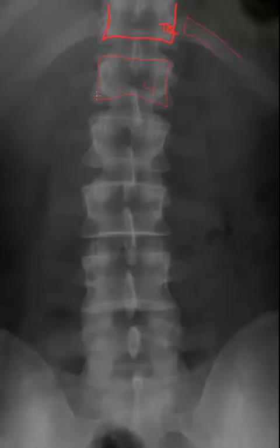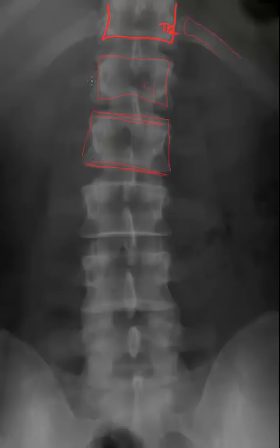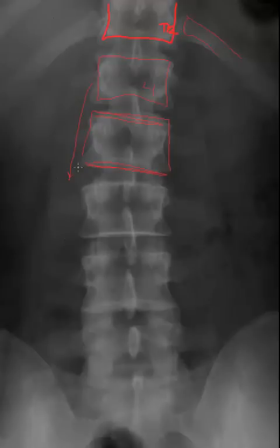The vertebral bodies can be seen very well, and each vertebral body has a superior and inferior end plate. This patient has a very mild right convex curvature of the lumbar spine. Anytime the lumbar segments are slightly tilted, the superior end plate can look slightly ovaloid or circular — like looking at a soda can from the side and tilting it slightly toward you so you can see its superior surface. With any curvature in the spine, vertebral end plates may look exclusively linear or semi-circular depending on the segment.